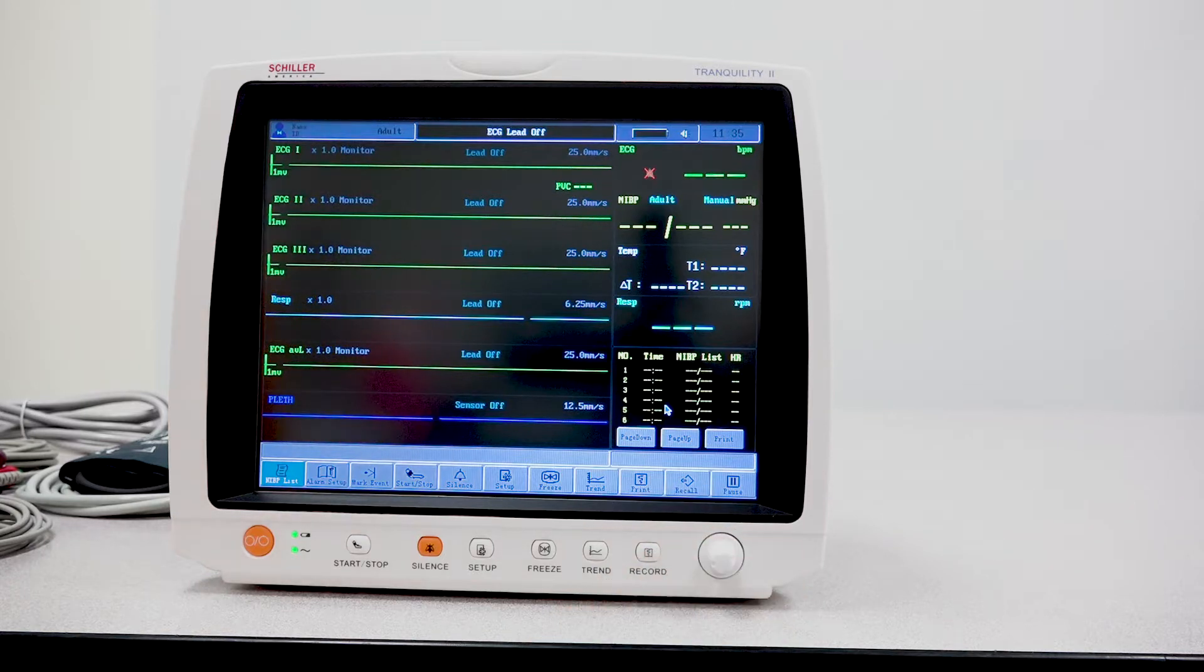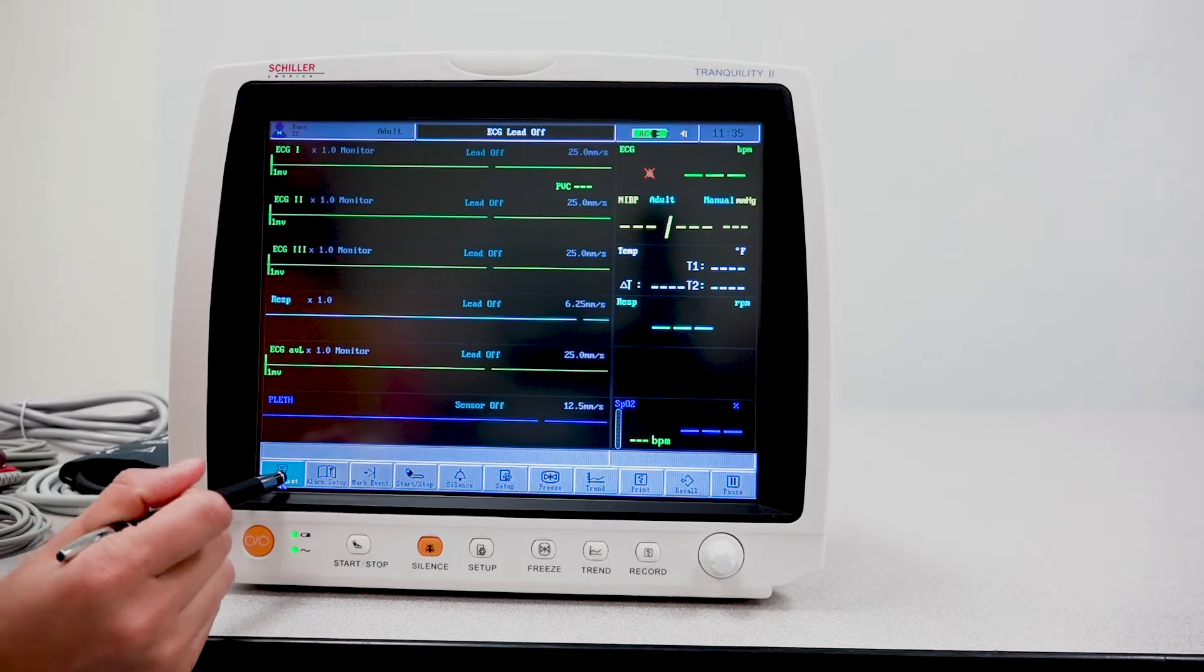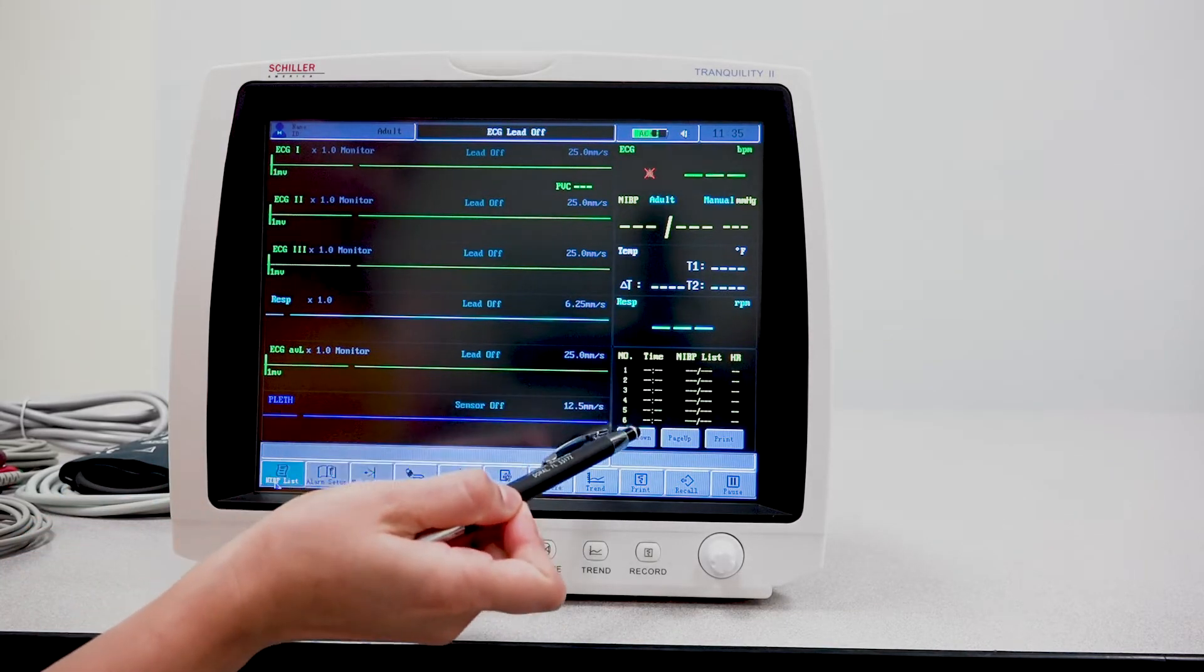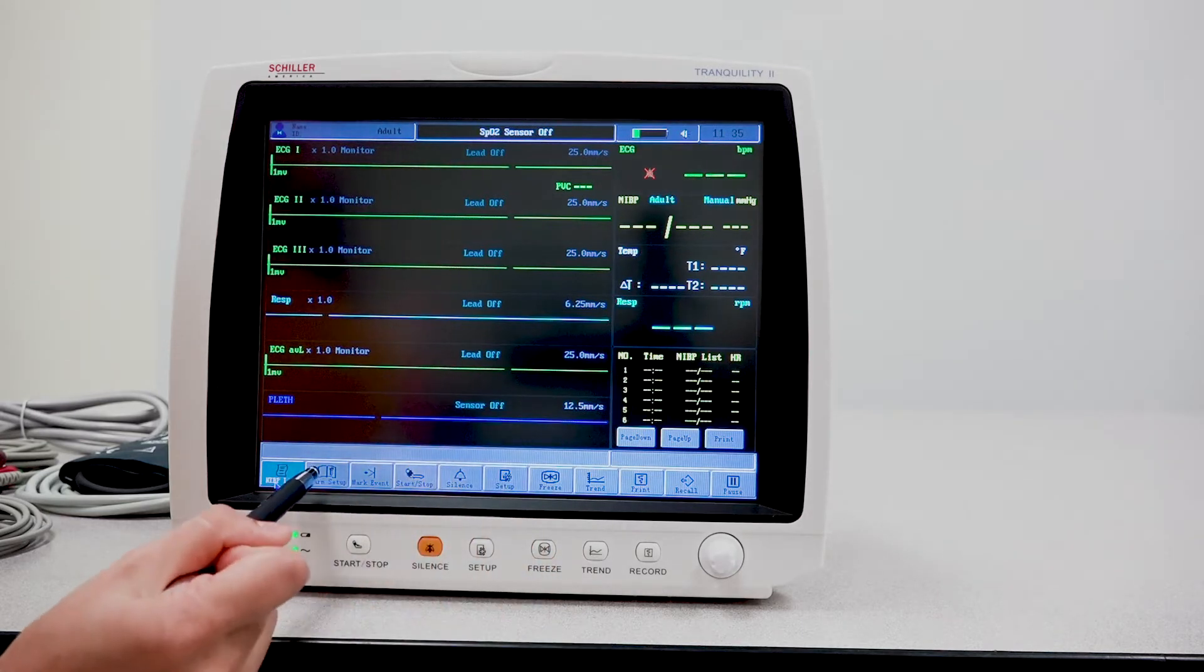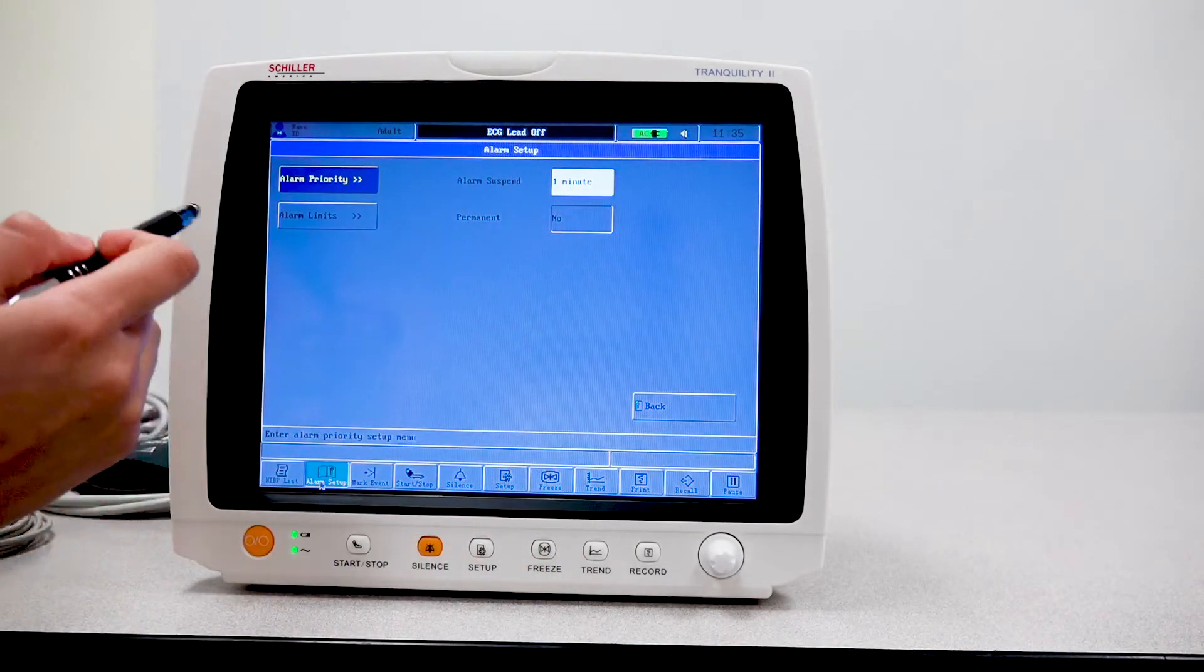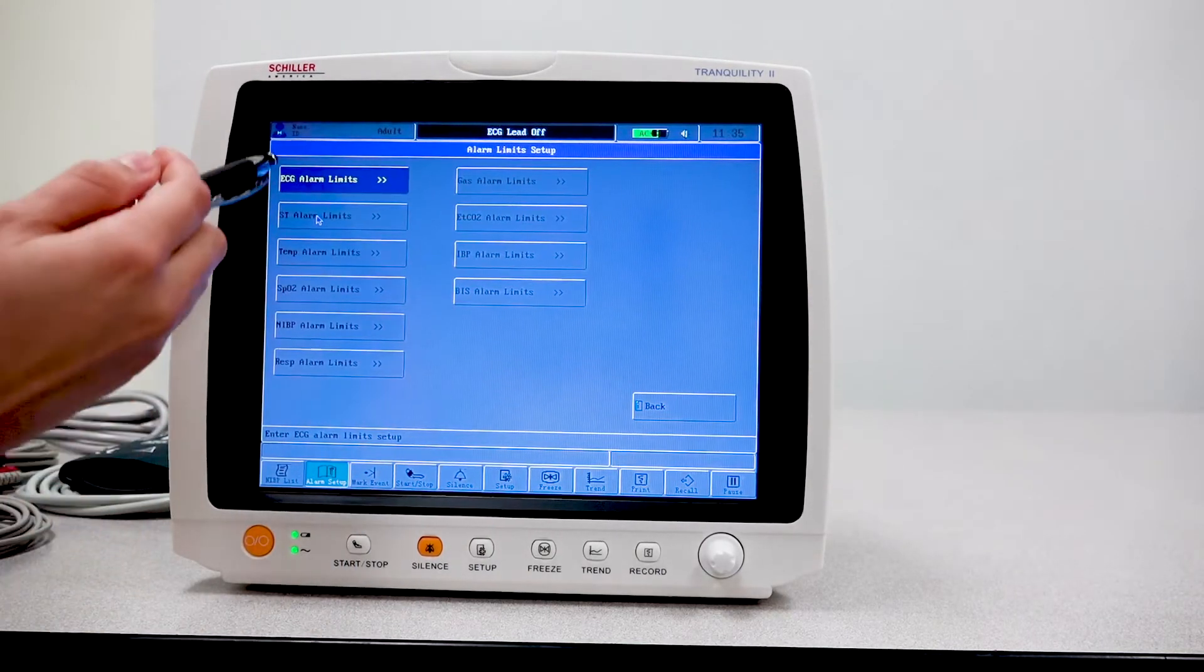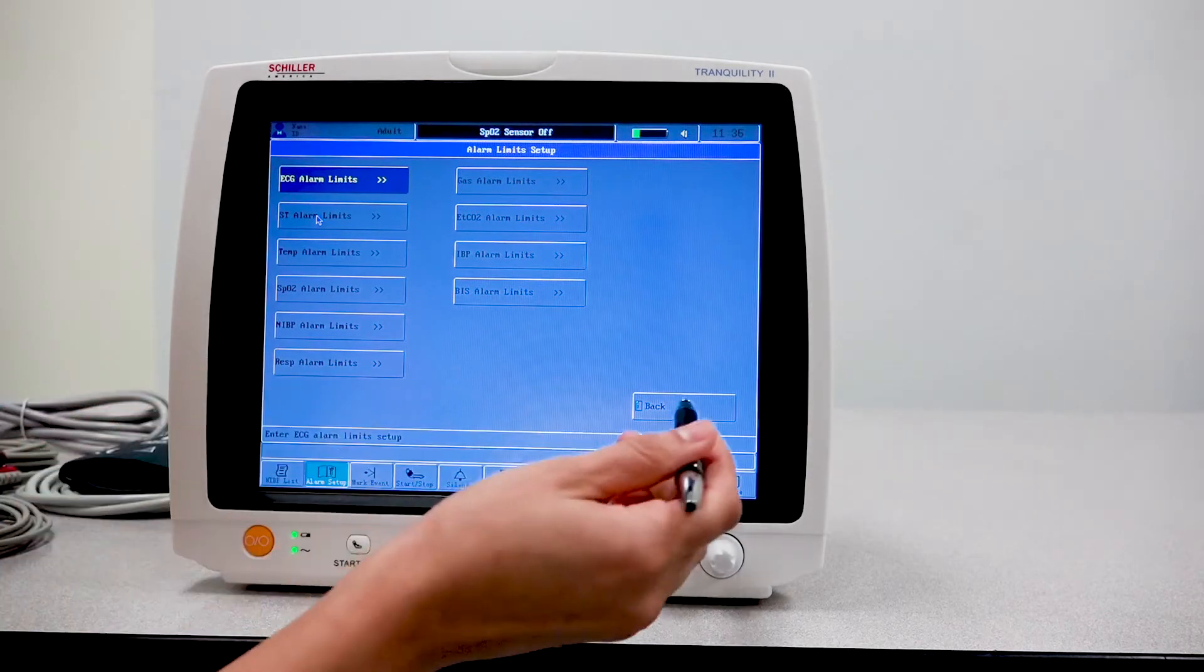The first tab that you have is your NIBP list, which if selected, you will be able to see here the measurements that were taken. Now with the alarm setup tab, here you have the option to set up your alarm limits for the different options.